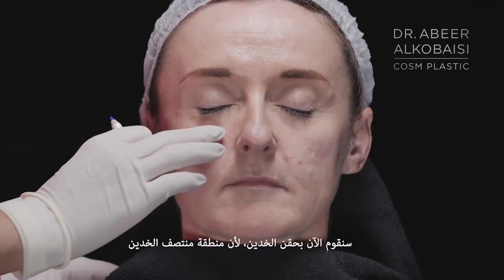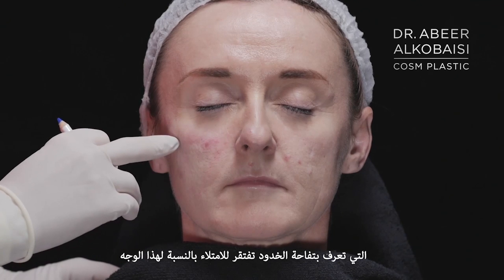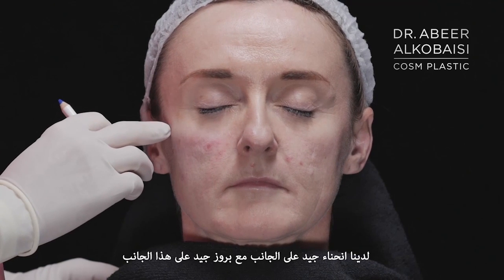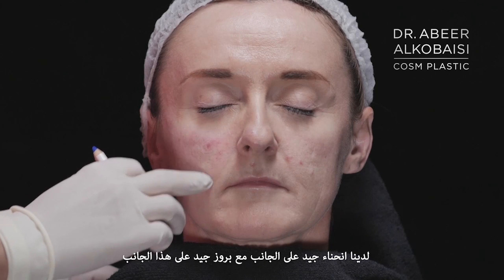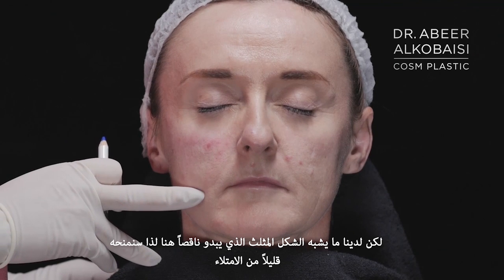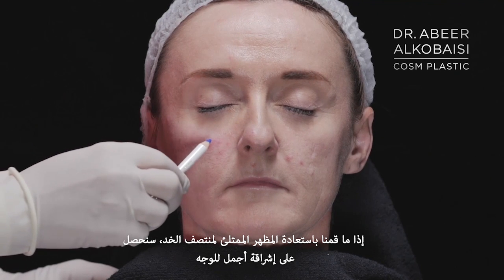Now we're going to inject the cheeks, because the middle of the cheeks, what we call the apple of the cheeks, in this face is lacking the volume. So we have good curve on this side with a good projection on this side, but there's like a triangle which is missing. So if we give it a little bit of volume to restore the volume of the mid cheek, it will give a nicer look.